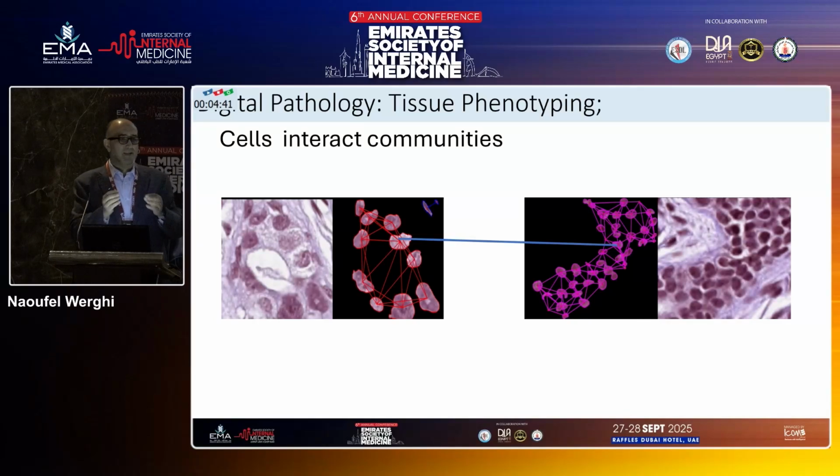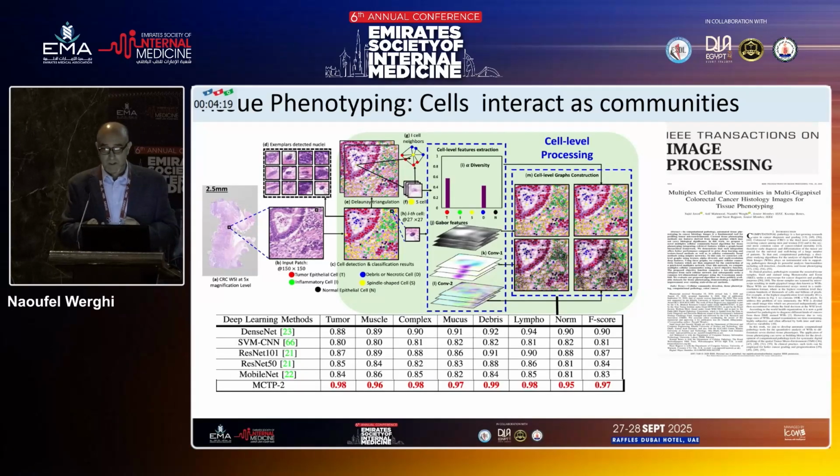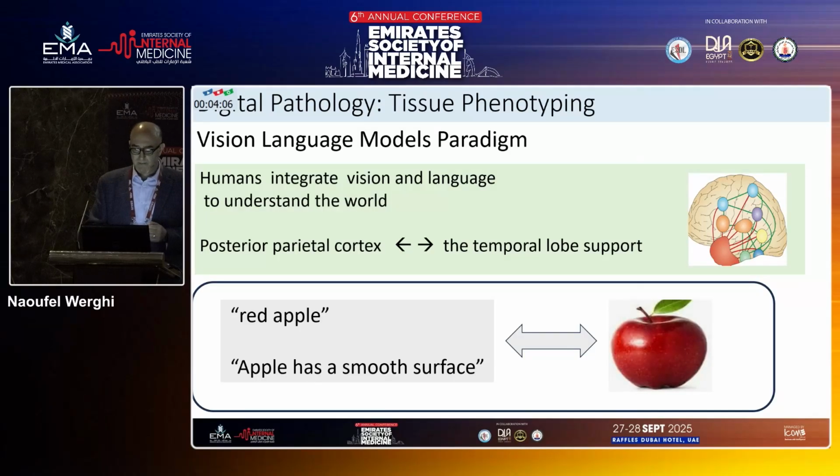A graph is a structure composed of nodes and edges. The edges represent a connection between two cells in our example. And then we feed our models with these two rich representations, for the cell itself and its surroundings, and we show that this helps to provide better representations of our cells. We presented this in the image processing journal about 2 years ago. So this is the full pipeline. We don't need to go too much into details, but this is one of the best ideas.